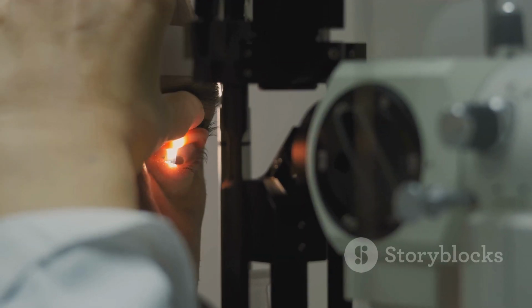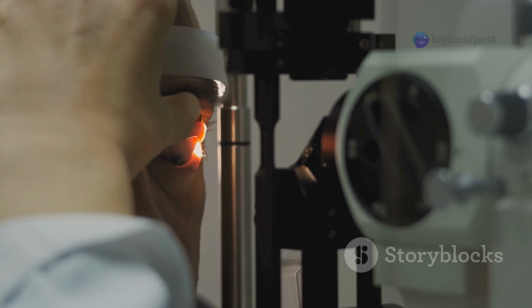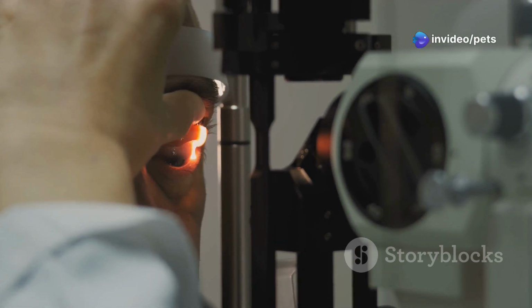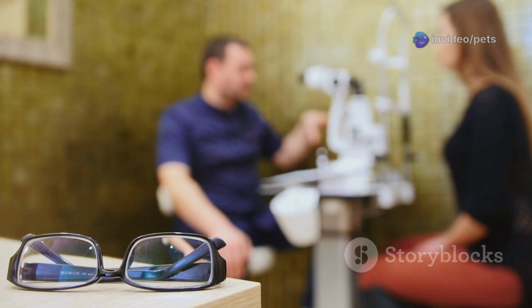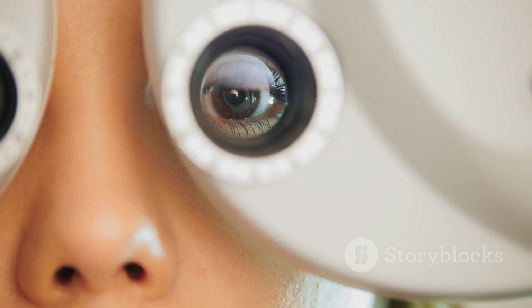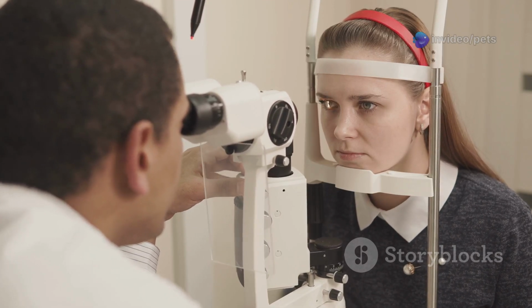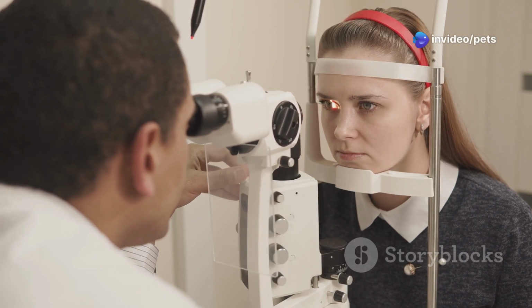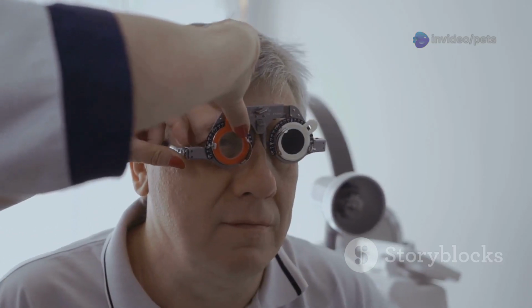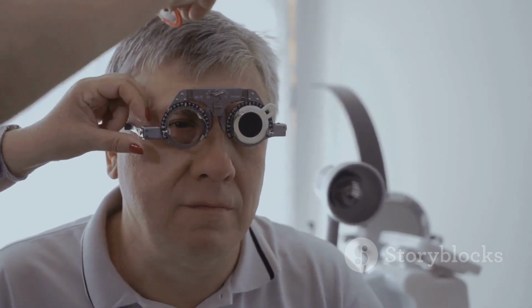To perform gross retinoscopy, the optometrist uses a retinoscope to project a streak of light into the patient's eye while observing the reflex through the pupil. The optometrist then introduces lenses of varying powers in front of the eye, carefully observing the movement of the reflex. The goal is to find the lens power that neutralizes the movement, creating a reflex that appears to stop or stand still. The lens power required to neutralize the reflex at this distance is recorded as the gross retinoscopy measurement.